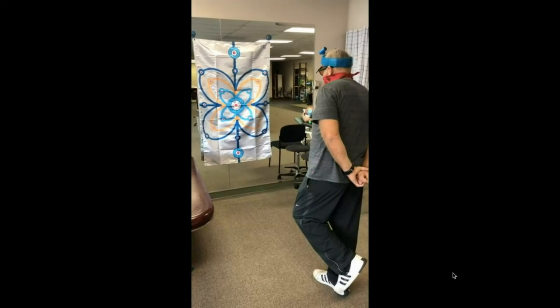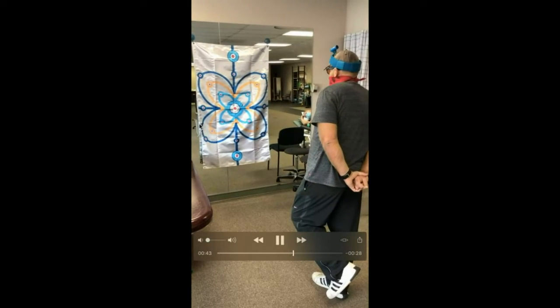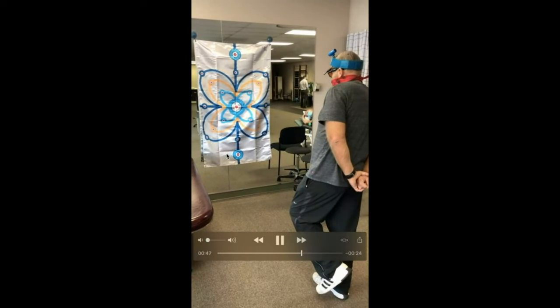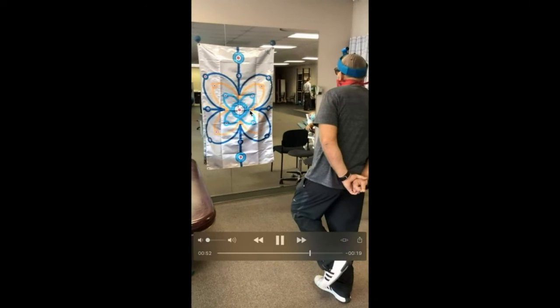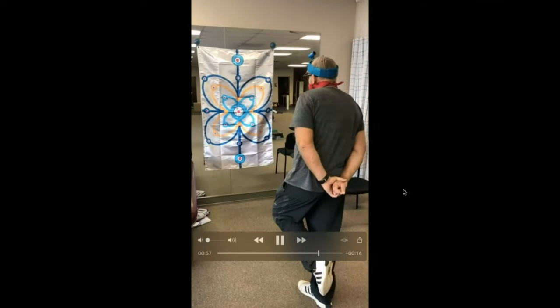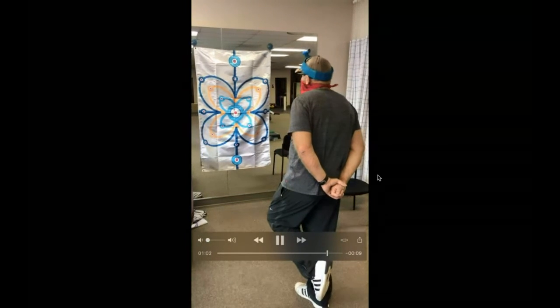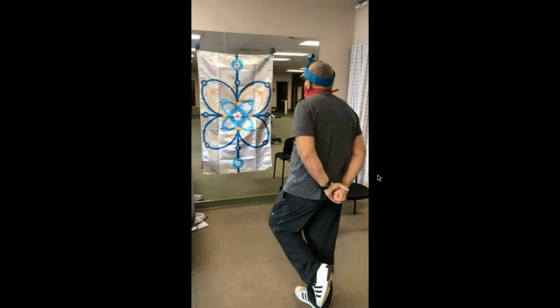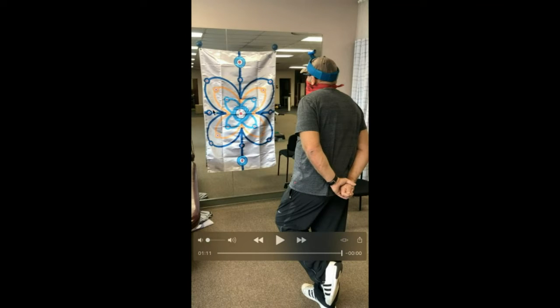Now, if you watch what happens when he's to the left, he really changes his control pattern. He freezes a little bit. He can't get back to the center. This one is nice and precise, and this one is still tough down there for him. If we compare that to the other side, which I think he'll go through next, got better there on that third one. As he starts to go through the other axis, down to the right and up to the left, much more comfortable for him to do that. Okay, so that gives us some indication by seeing that immediate visual feedback.